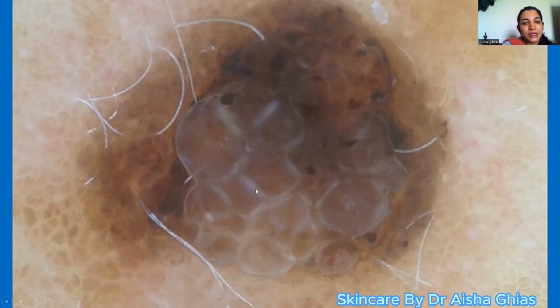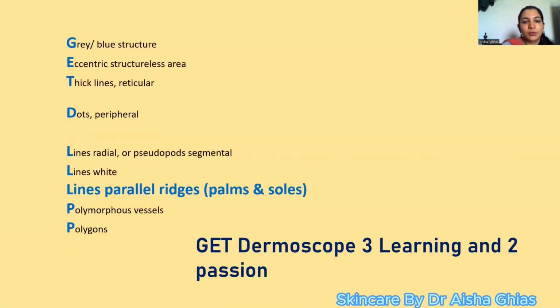So why are these made? These are made up of the altered collagen, which is formed as a result of the malignant process over there. So the birefringence properties, the color reflectance properties of the collagens are altered. That is formed later in the process of healing, with proliferation and healing and trauma going side by side in one case of malignancy. So then you see these white lines or white streaks because of these altered properties of the collagen that is made over there. Okay, so this was the white lines. It's a clue to malignancy, and you really need to cut this lesion out wherever you see these white lines on dermoscopy, on polarized dermoscopy.